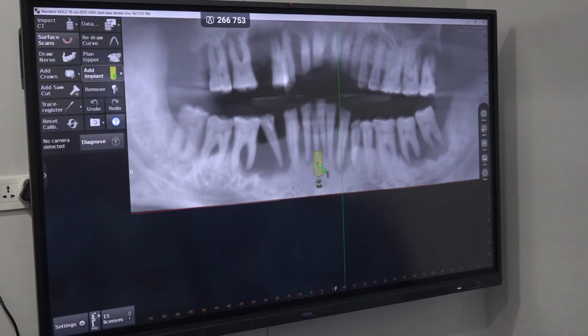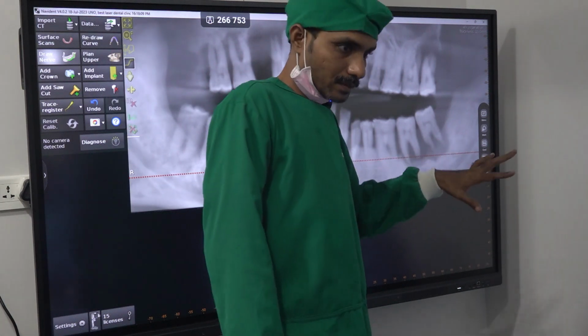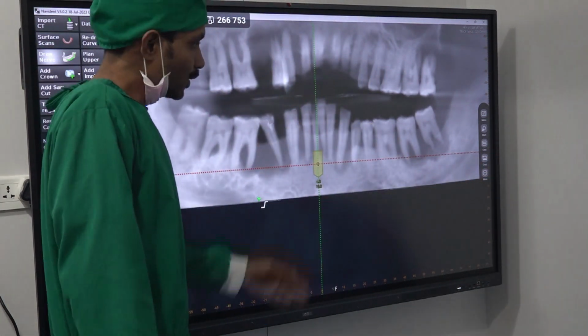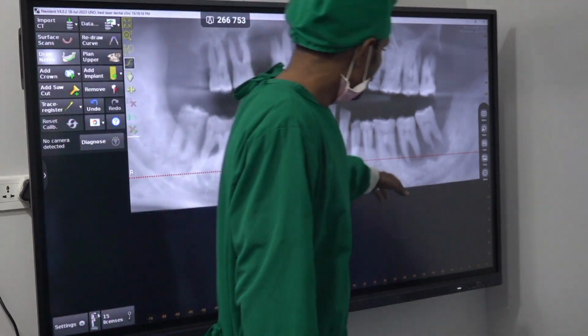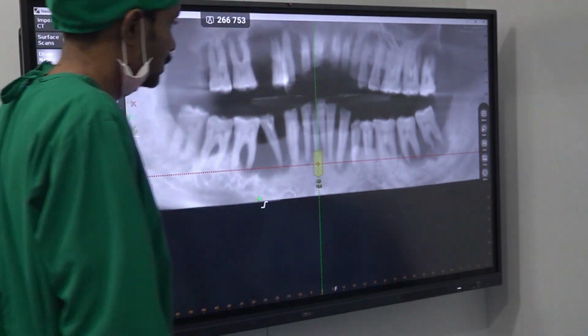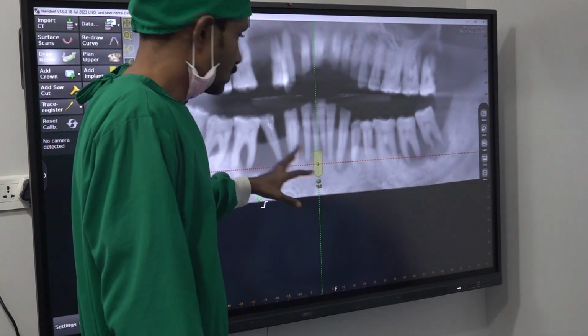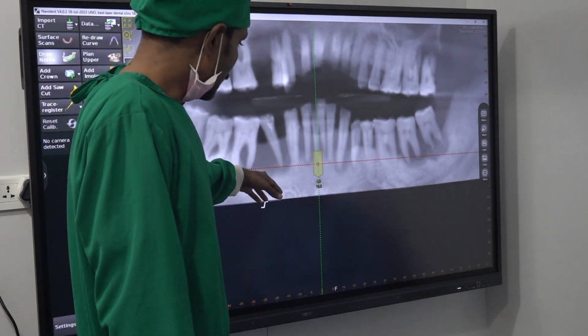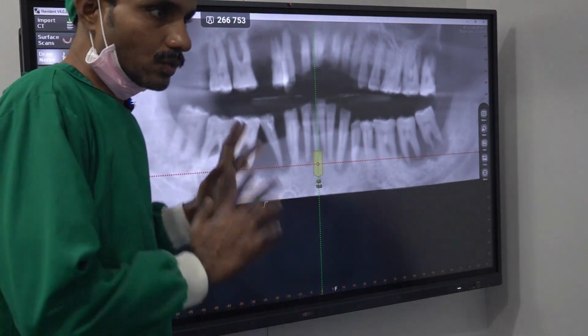So first we will go for the lateral incisor. As usual, regular planning: interforaminal 4 implants, distal mandible 1 or 2. By seeing it, we come to the conclusion that 7 and 8 are better avoided. There will be severe bleeding. Even if you plan nicely, a lot of bleeding will happen. So better to place 1 implant in the 6. Here the mesial root is totally gone, right? Here the mental foramen, here the mesial root. Either the distal root or 7 looks good.